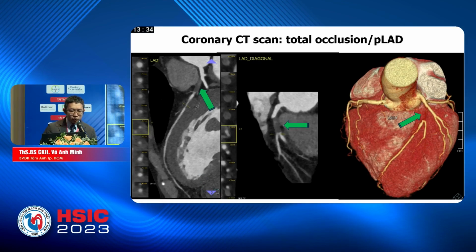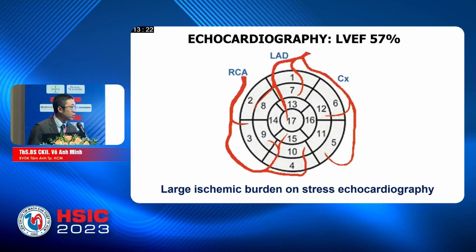But interesting in this case, the CTO ended just before the carina point, around 1 millimeter. Further investigation with echocardiography showed the LVEF is 57% and a large ischemic burden on stress echo.